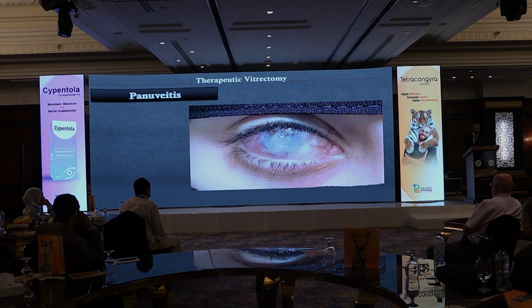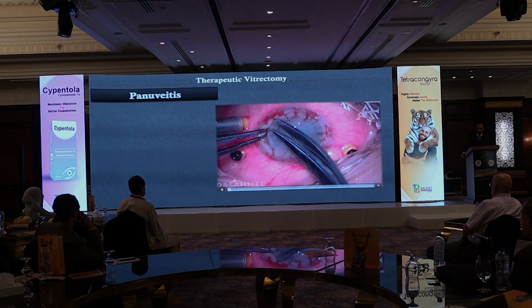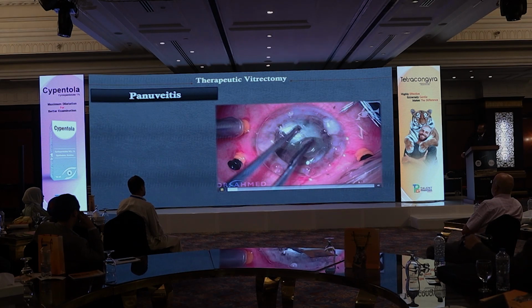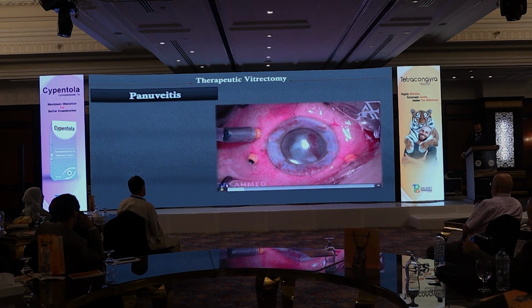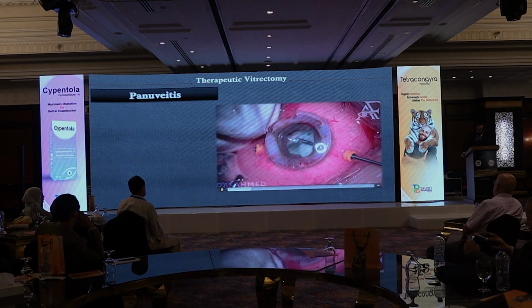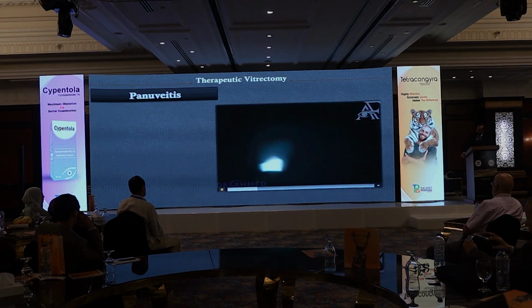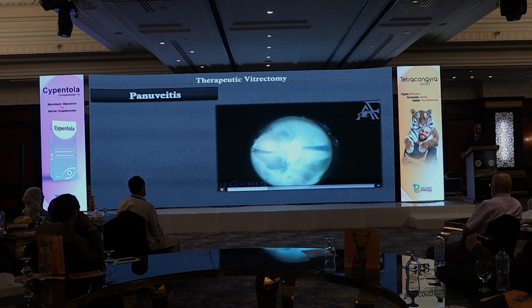Another case of PPV in uveitis, and the last one, I guess. Bardo referred to us, keratoplasty, tectonic graft for infective keratitis over the previous graft, but it developed into endophthalmitis. So we tried to do penetrating keratoplasty with vitrectomy. This one was a really aggressive infection. As you can see, it's really dark in here, and we are trying to go through it.